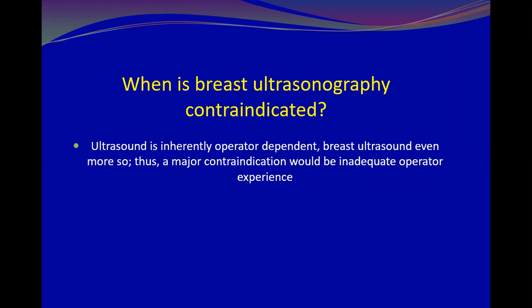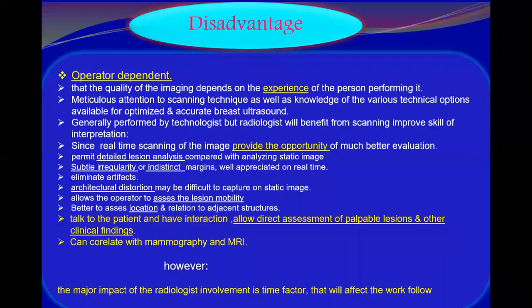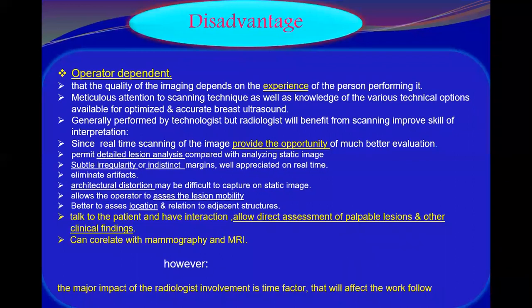Not related to the patient. It is related to the operator. So, as you know, ultrasound is operator dependent. It depends on the experience of the person performing the ultrasound. It needs meticulous attention to scanning technique and knowledge of various technical options.